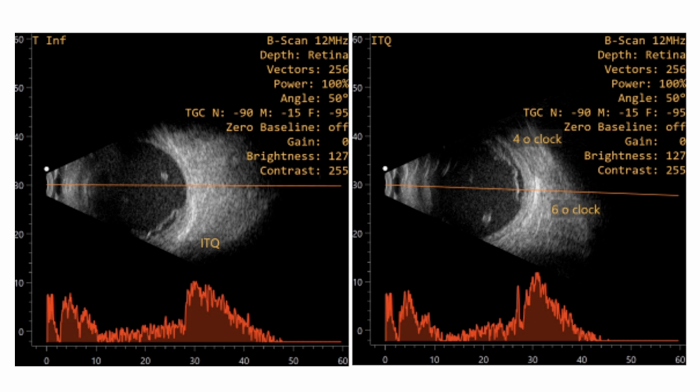Could this be a vitreous membrane? It's a retrospective diagnosis, ma'am, what she says. But initially I also thought it is a vitreous membrane. Could be an uncut gel also. We may not be able to do a complete vitrectomy at the end of the case, but later it became a subtotal RD and then we realized that the area has opened up. It was a retrospective thing.